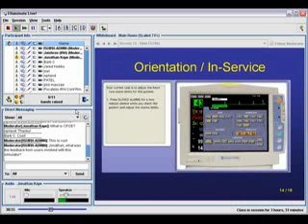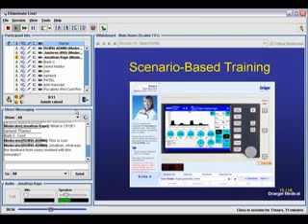Let me skip over to, since we're talking about ventilators, I think one of the most important aspects in creating good training is to make it feel like the real thing, make it relevant. Even operational things, when you're learning to operate a device, can be cast into a scenario, a case study type of format. It makes for an overall better, more compelling experience. And certainly if they're operating in a simulated real case, you have a better sense of how they would perform in that case.